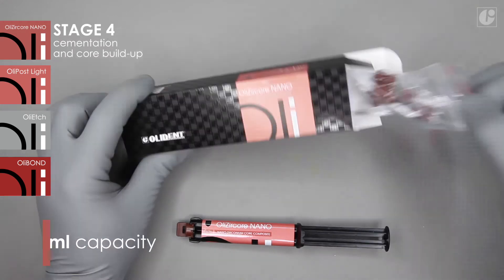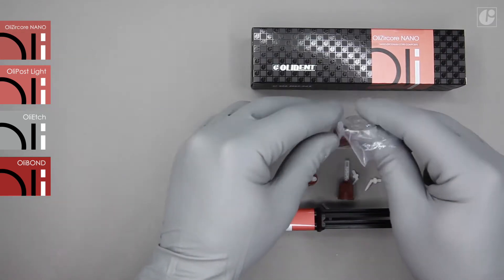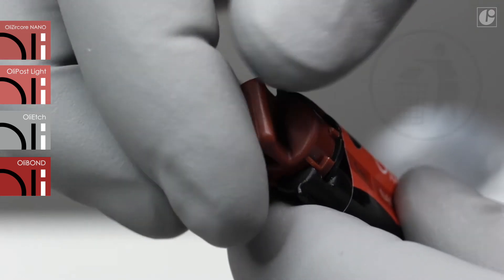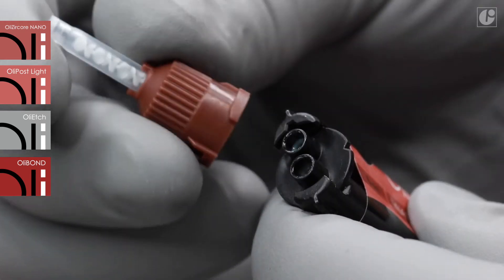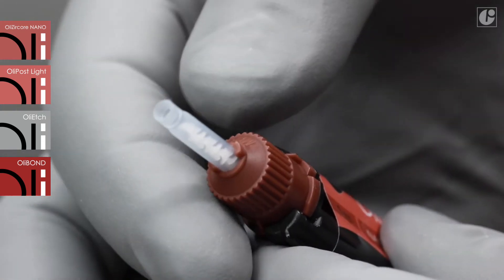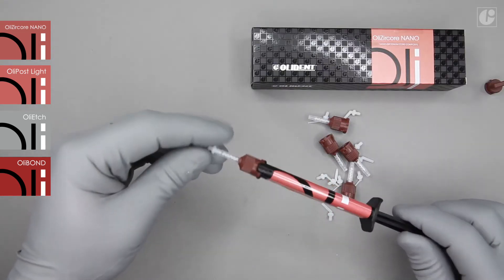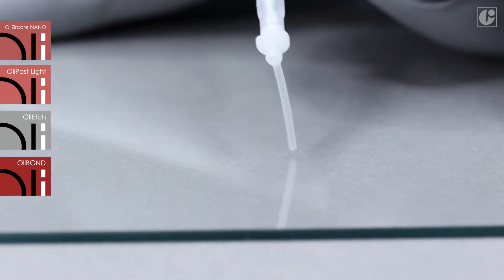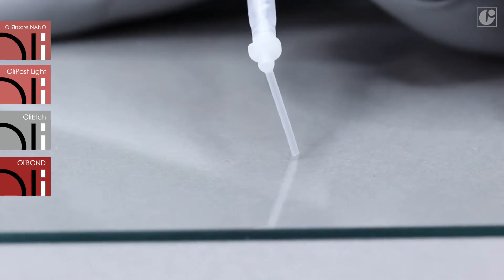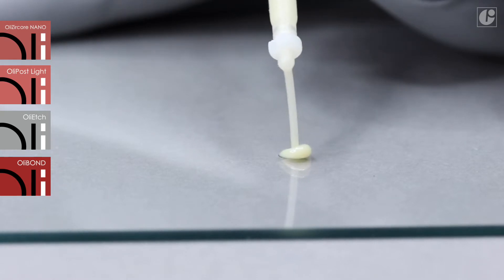The OliZircore NANO set includes a 5ml syringe, mixing tips, and two types of intraoral tips: short and long. The safety plug should be removed and discarded, and an appropriate mixing tip needs to be attached. After application, it will serve as a plug until next use of the syringe. During the first application, it is important to squeeze out a small amount of the material and discard it. This is commonly recommended for dual curing materials as it aligns the base and catalyst inside the syringe.